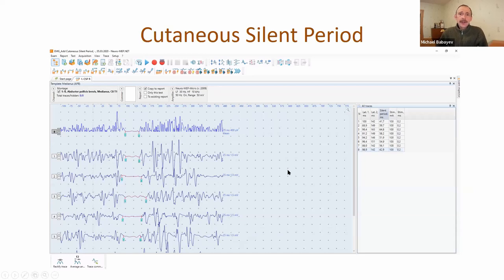Another technique: cutaneous silent period. This technique is useful for examining small sensory fibers - it is a reflex response. We stimulate sensory fibers and record a response from the muscle. It looks like a magnetic stimulator silent period, but here we use an electrical stimulator. As you can see, there is interference pattern because the muscle is contracted. At zero time we apply an electrical stimulus, and with some delay we can see the silent period.